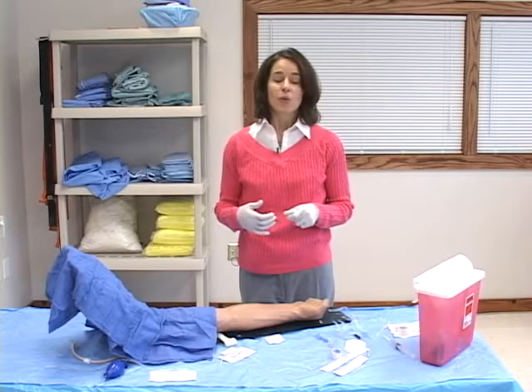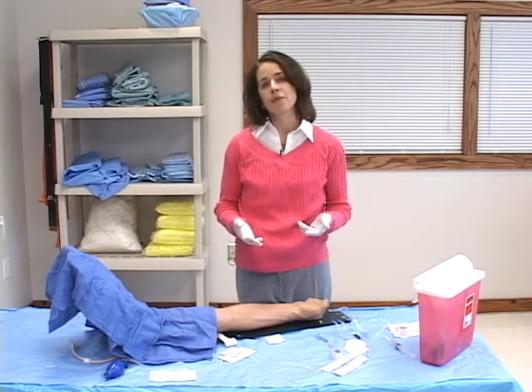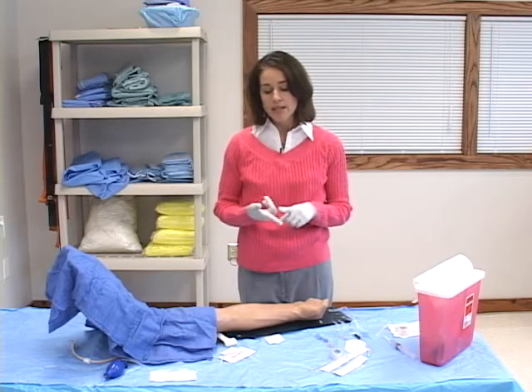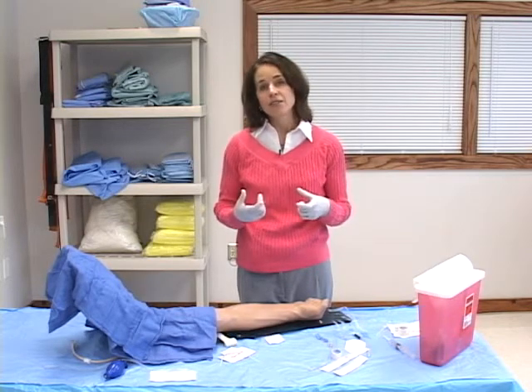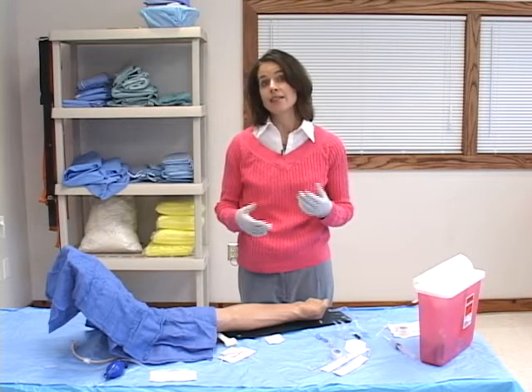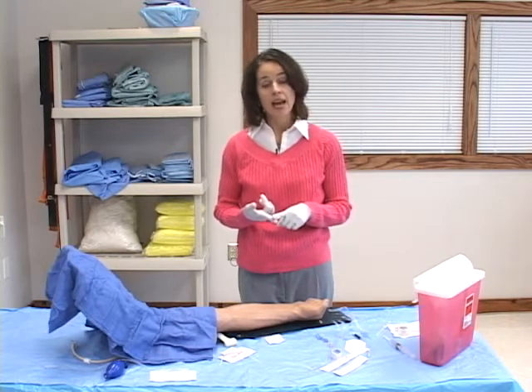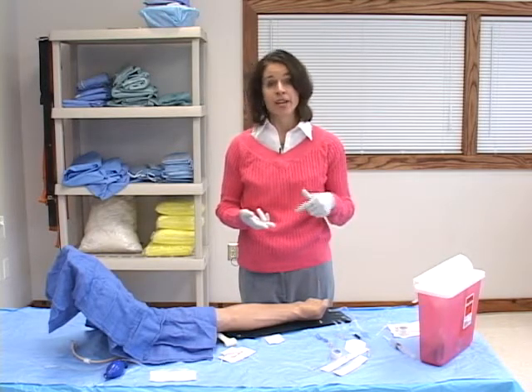Now, we are specifically talking about starting pediatric IVs, and there are some things you need to remember for the pediatric population. One is that younger children have a thicker layer of subcutaneous fat, and that often makes it more difficult to visualize the vein that you are sticking. So you need to be skilled at palpation and knowing your anatomy of your veins.